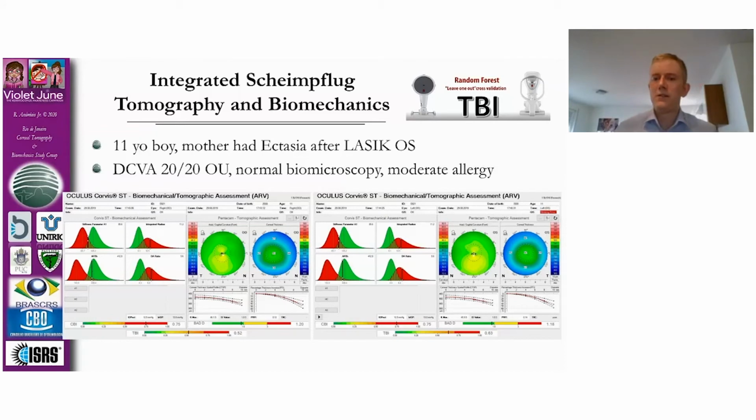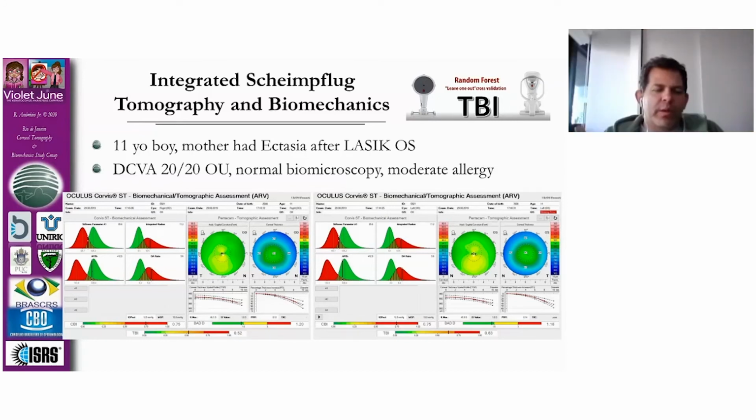Yeah, Renato, do you want to comment on that? But I think you agree mostly, right? I agree. Yeah. I think when we go beyond the understanding of multimodal imaging towards the understanding of ectasia risk in a broader range, we are looking at the risk of ectasia progression.